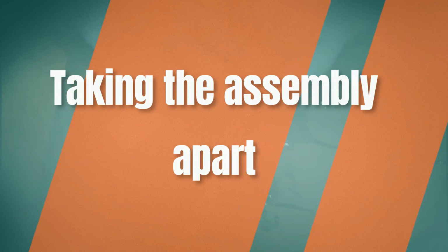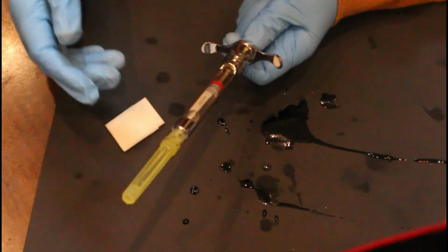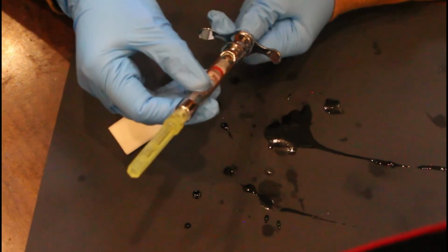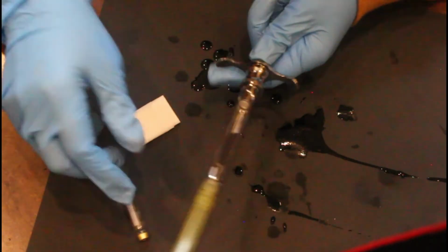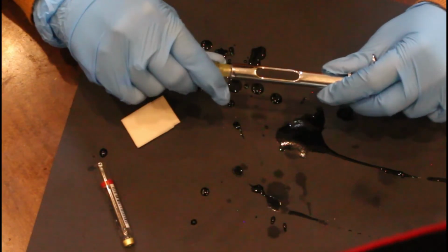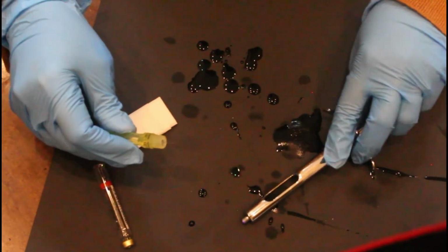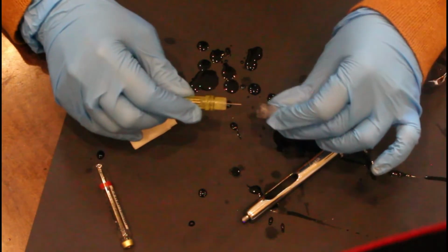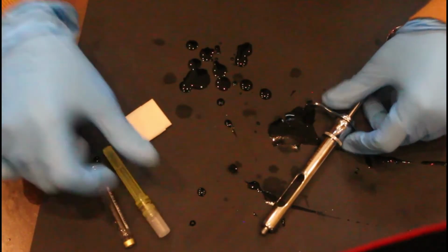Now let's disassemble the whole setup. Whatever goes in first comes out. So in this case, we pull the plunger out, take the anesthetic carpule out. Next thing is the needle. You unscrew it till it becomes loose, then simply drag it out. Put the small part of the needle cap, used carpule, and the needle into sharps and the syringe goes for autoclave.